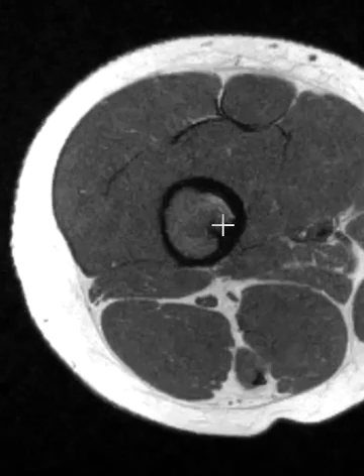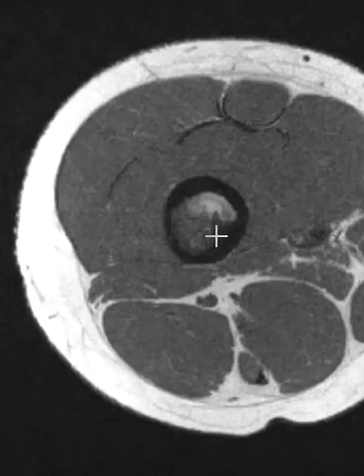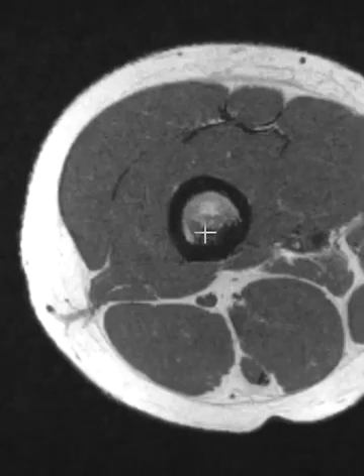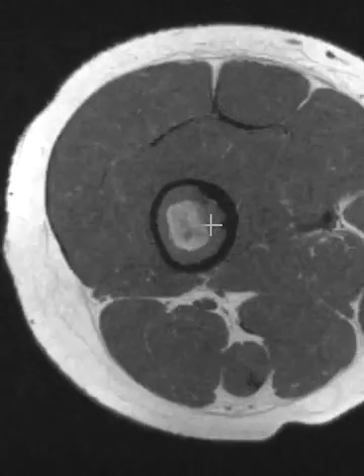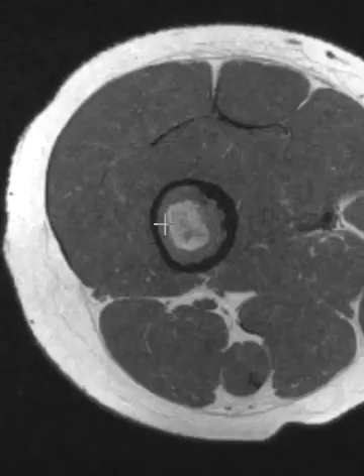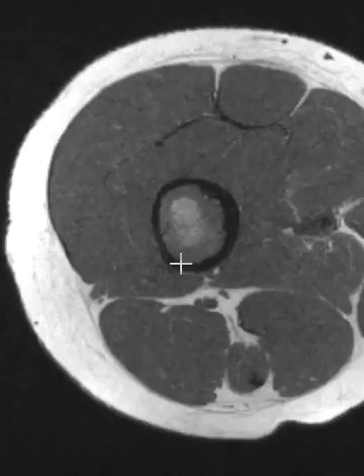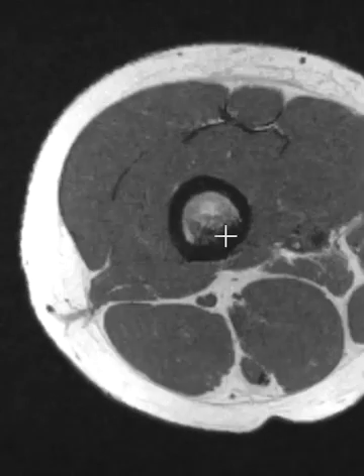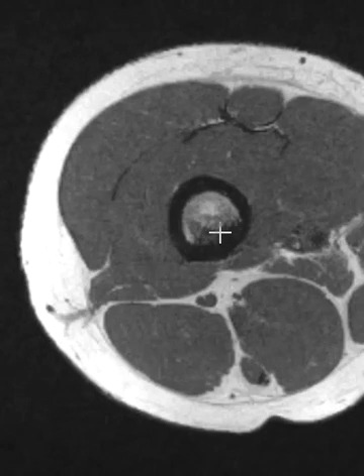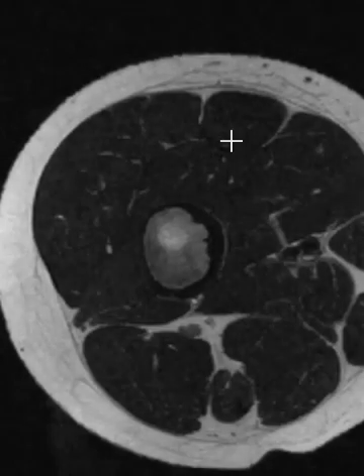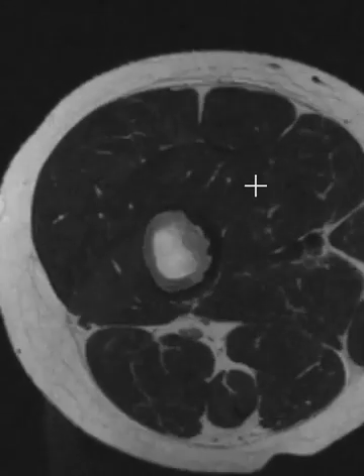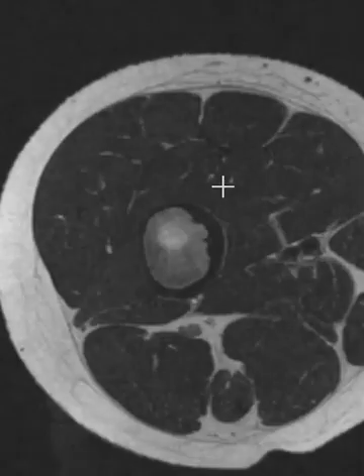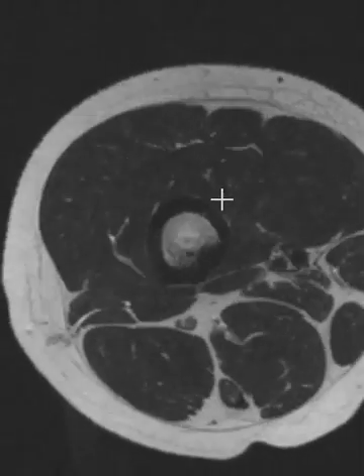Distally, we see this funny area of darkness here. This causes bony sclerosis along the inferior margin, so it has marrow elements, endosteal scalloping, it looks like it's minimally expansile, and it has this dark area down here in the bottom. This is a T2 weighted sequence, so it'll look very similar to the T1 weighted sequence. There's no fluid pockets within it.